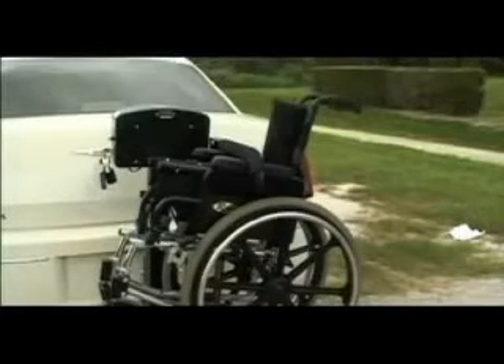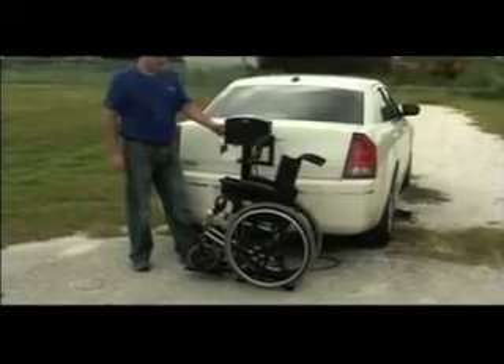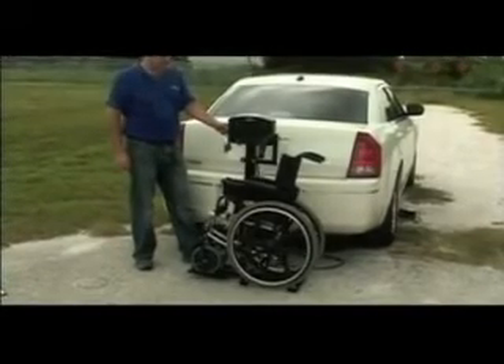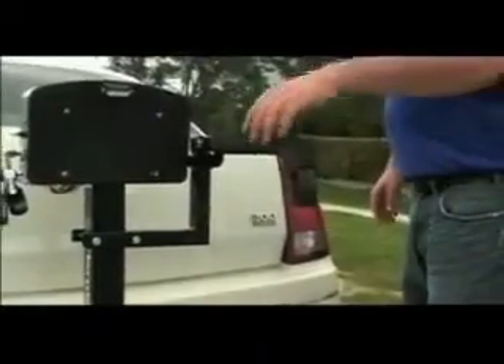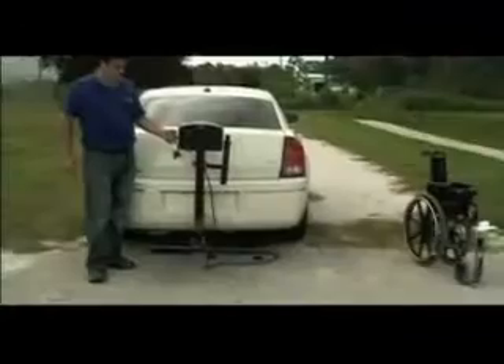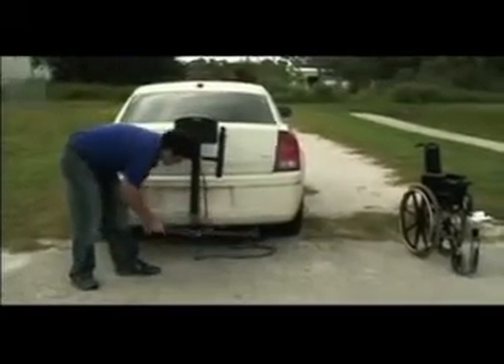The chair is now ready for transport. To remove the chair, power the lift down until the platform touches the ground. Guide the chair back off of the lift. Fold the hold down arm completely. Raise the lift, stopping to manually fold the platform.